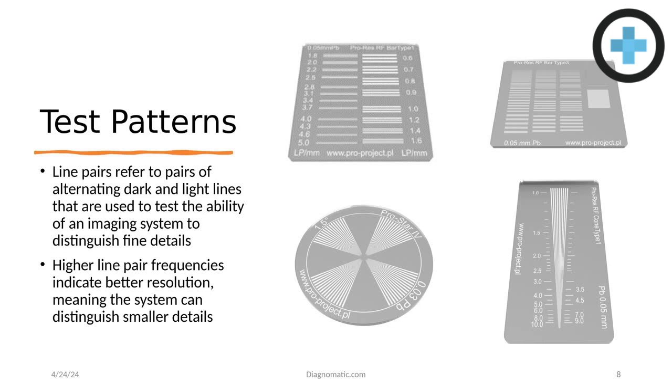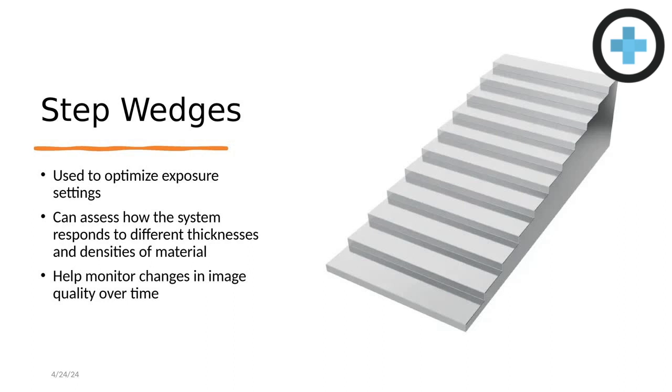Again, it's important to know which bar type is going to be best for the system you're working on or the regulations you're working with, and which will best suit the equipment you're using.